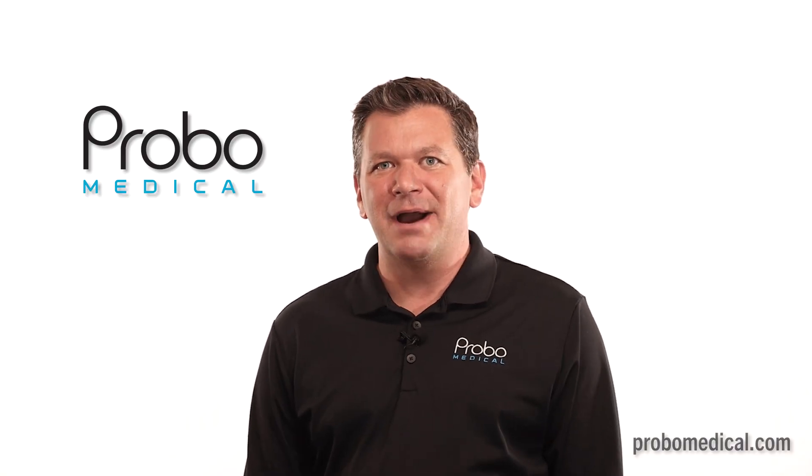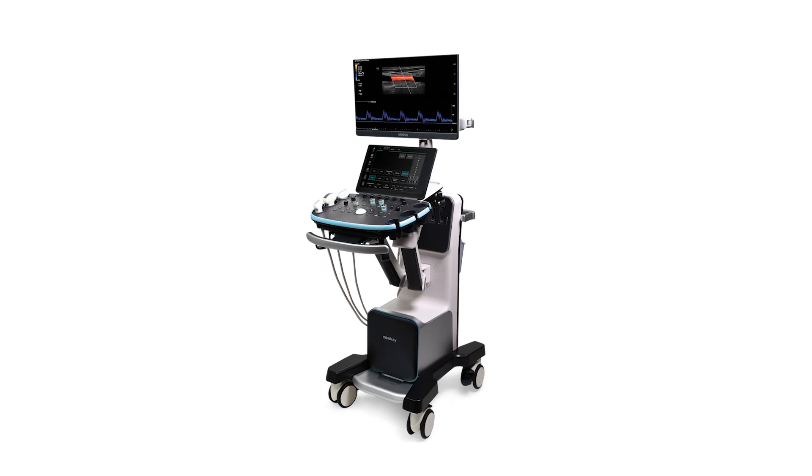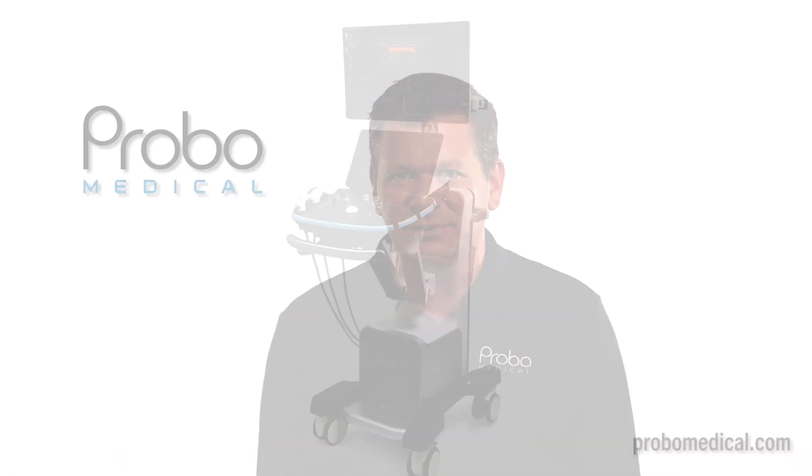I'm Brian Gill with Provo Medical, and today we're looking at the Mindray Resona i9T mid to upper range shared service ultrasound machine.